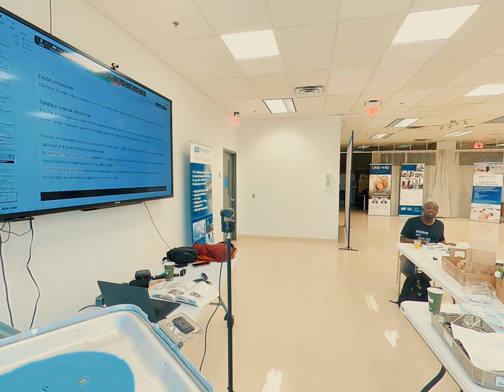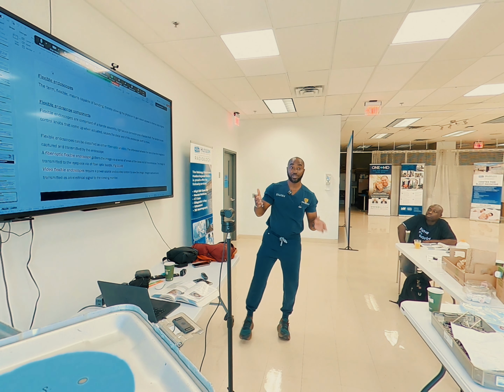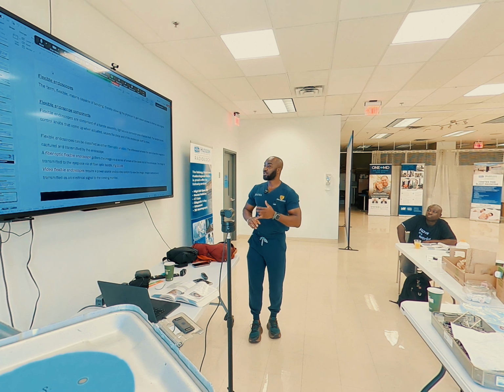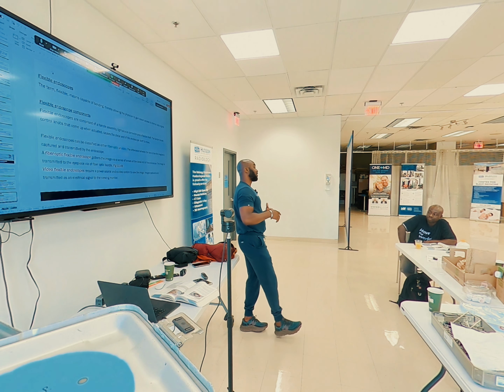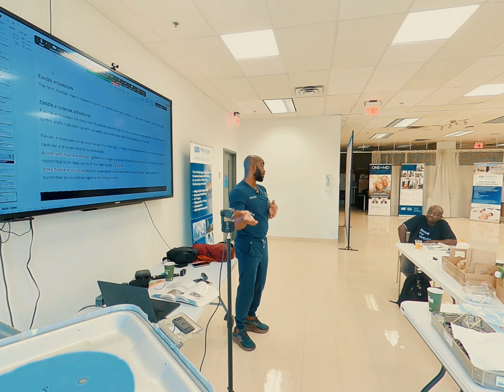That is an incomplete question actually, because it should give you an option. Because you can do it. You still can do it. You are allowed to do it if you don't have the machine. So the question should be complete, because the only way to perform high level disinfection now is by mechanical means, right? By the endoscopic processor.